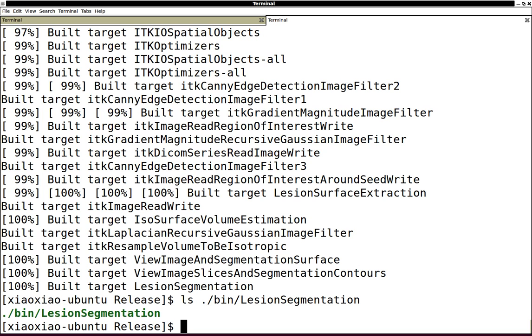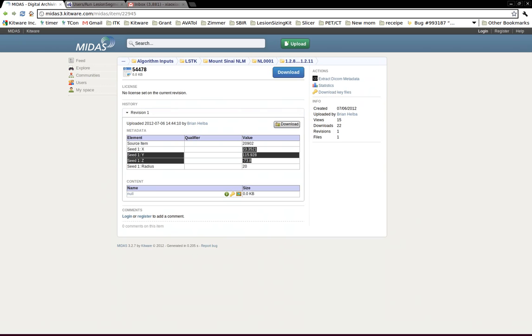This is the executable we're going to run to get a segmented tumor out of a lung CT image. For the specific command line, you can refer to the wiki page. Wiki page is here.